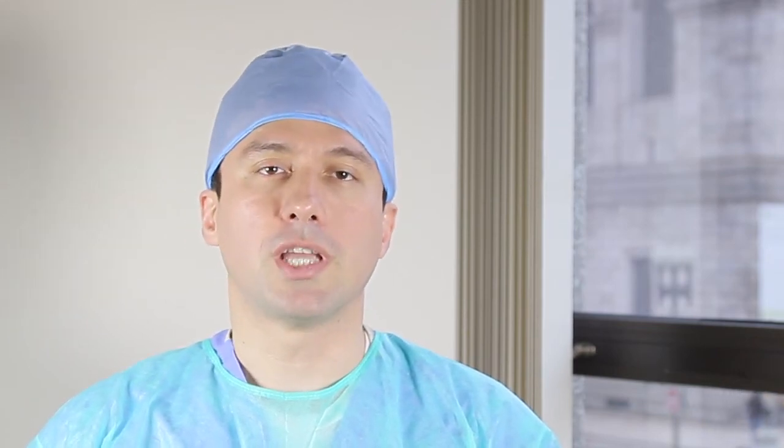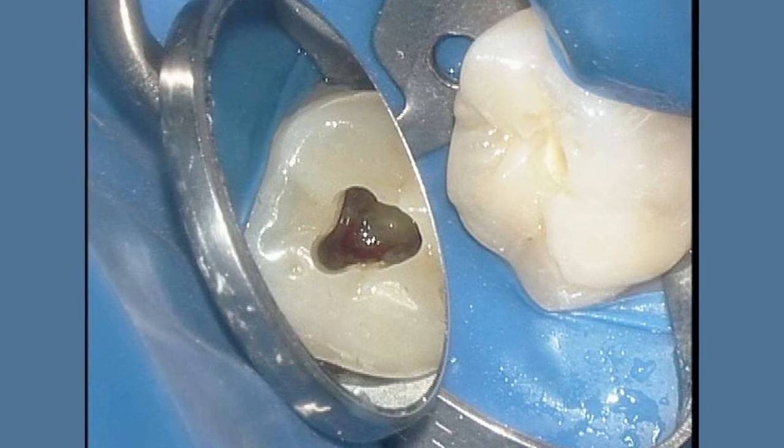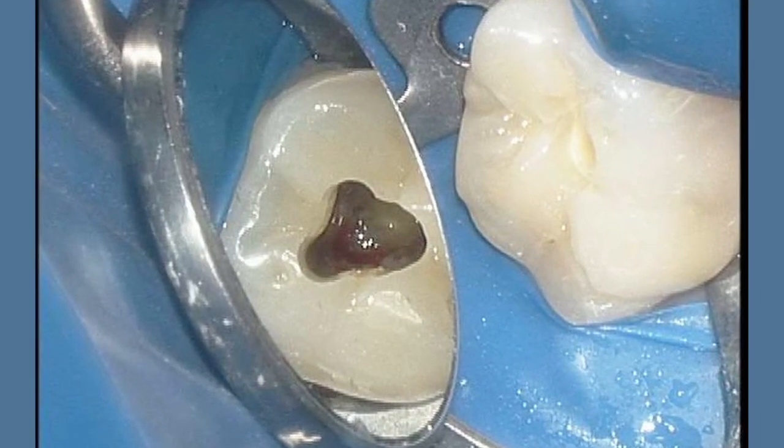In this case, the patient recalled banding of the tooth for orthodontic therapy several years earlier, which may have been a contributing factor. As a result, endodontic therapy was initiated and upon access, the large area of resorptive defect became clear in the mesobuccal area of the chamber.